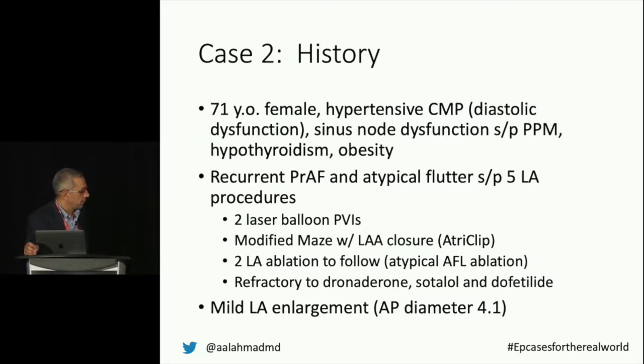Any comment? I maybe missed some of this, but I came in at the point where you're talking about getting into the coronary sinus and taking it quite a ways out. Before, he said you do it endocardially first, before you go epicardially. Understood. But there are so many times when you try endocardially and you just don't get it, and you have to go epicardially.